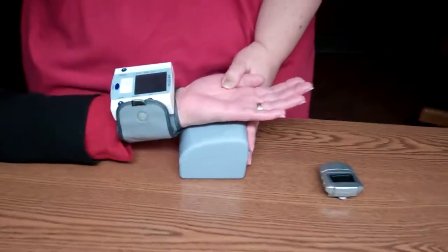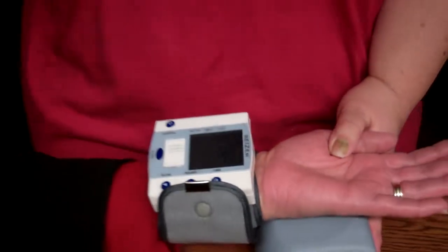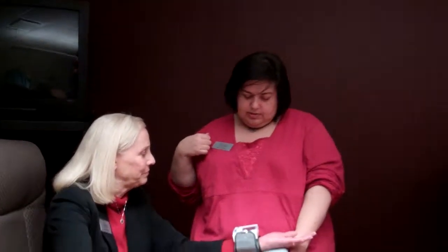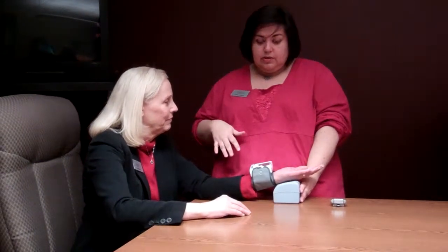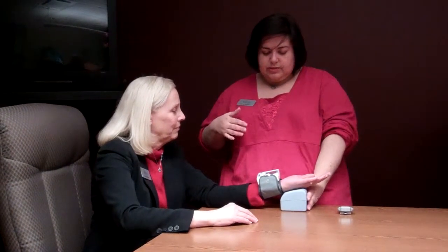We've noticed it doesn't get as tight as an arm cuff at the doctor's office, but it still takes an accurate measurement of your blood pressure. It does display the numbers as well, but once it gets your blood pressure and your pulse, it will announce it.